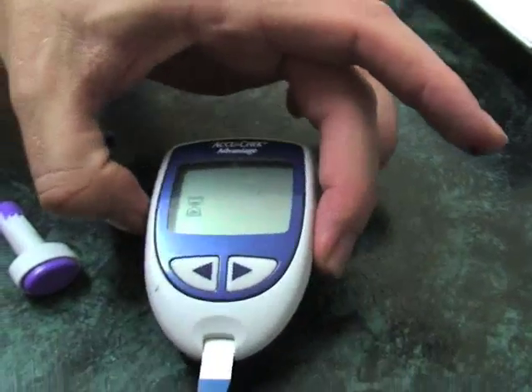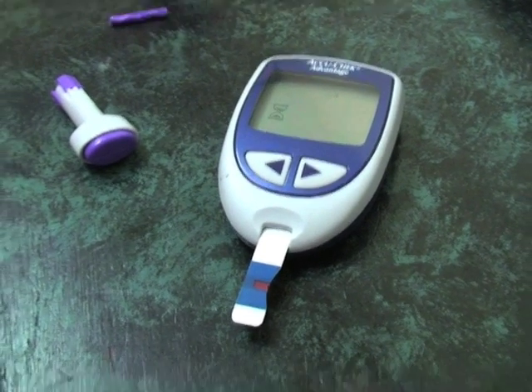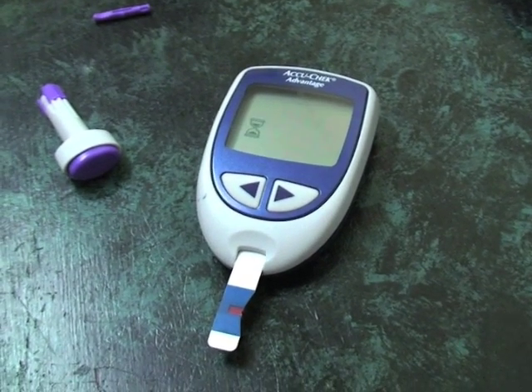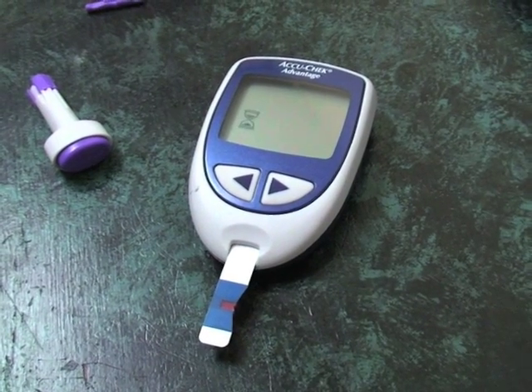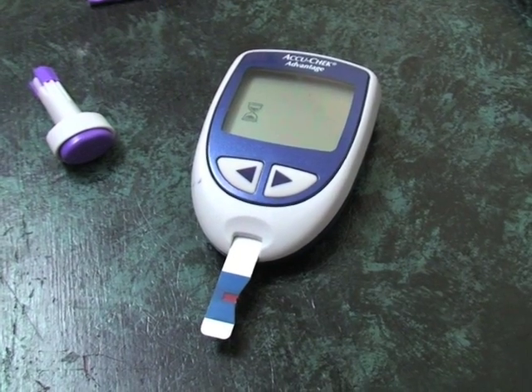You can see now, if you watch the meter, you'll see that it's just processing, and soon it should come up with an actual blood glucose reading. Normally, it takes about 10 seconds.